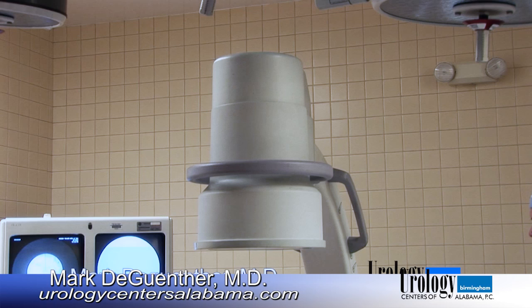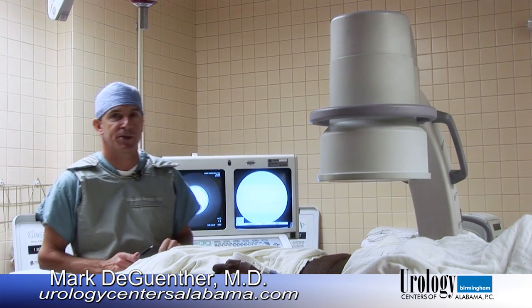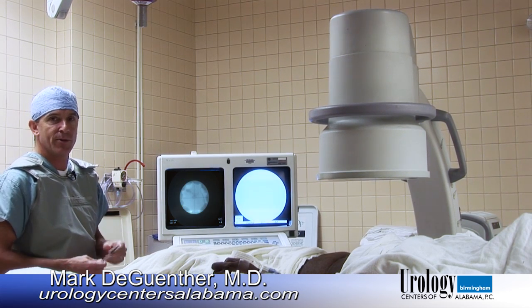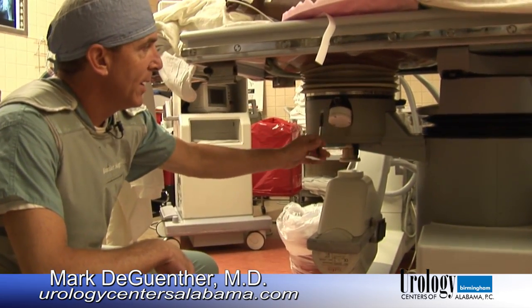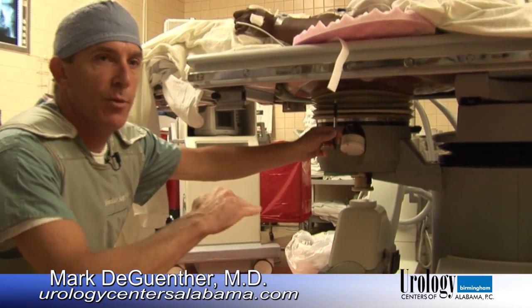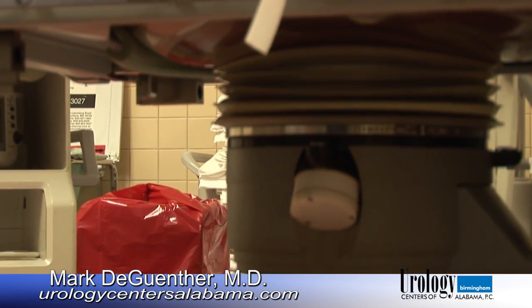This piece of the equipment is the fluoroscopy unit. That's what's generating the x-rays and transferring it to the screen where we can monitor it throughout the procedure here. The shock waves are actually generated in this part of the equipment. This is located directly under the stone, and then we move the patient up and down to get the stone at the tip of that cone, as I had mentioned.